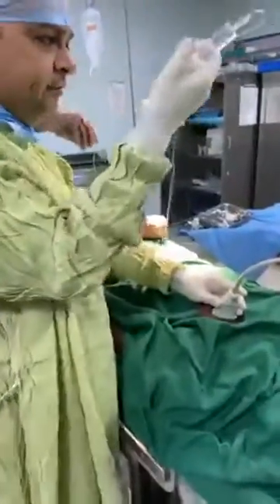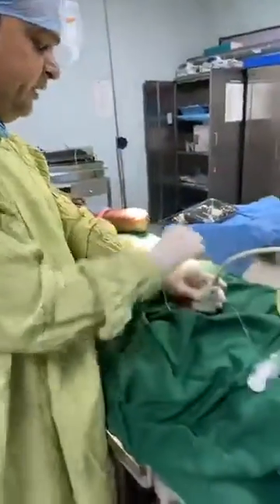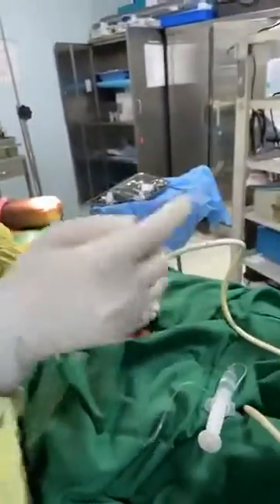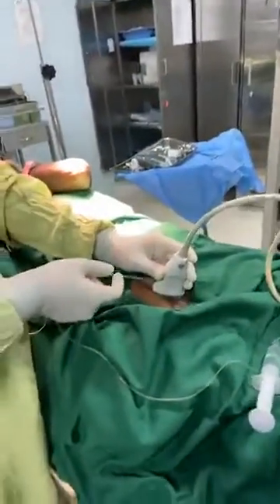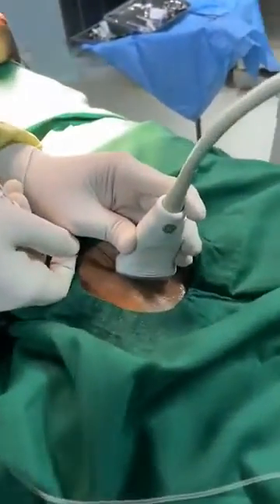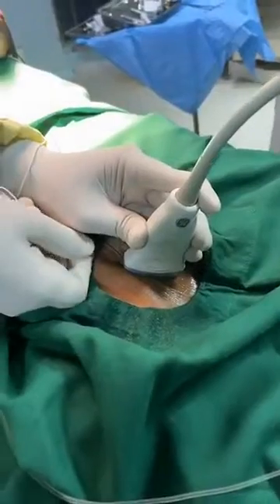So I will start giving the block now. I have taken 20 ml of 0.375% bupivacaine. This is a 100 mm Sonoplex needle. I will go in-plane from lateral to medial side.